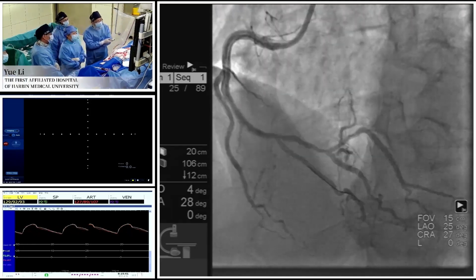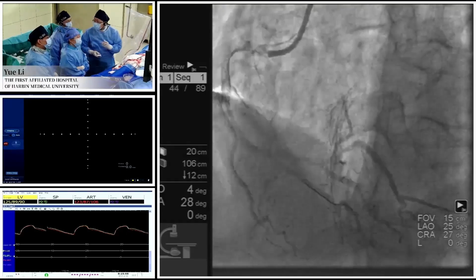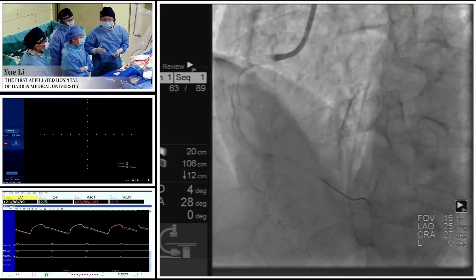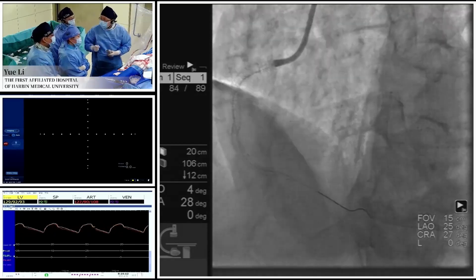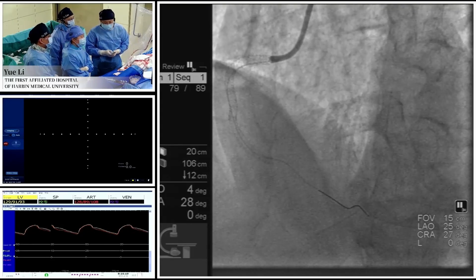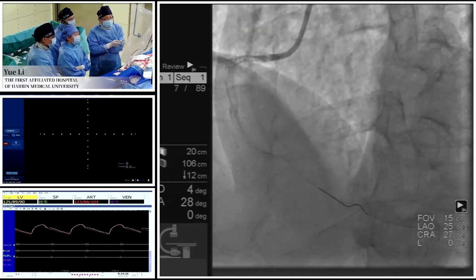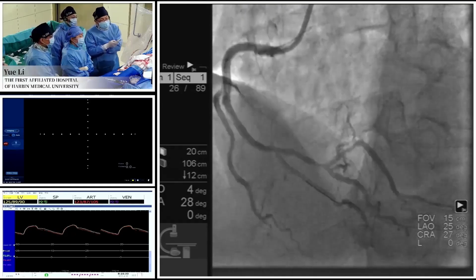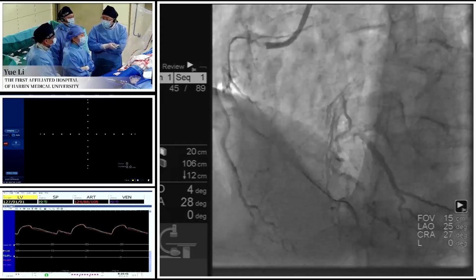Firstly, we do the RCA angiogram and use just a Judkins Left 3.5 guiding. I think this guiding for the transradial approach has stronger backup support than the common Judkins Right guiding. One tip and trick is to straighten the second curve of the guiding a little bit. So this guiding can easily deep seat, and could give relatively enough backup support. And certainly, if the backup support is not enough, we also could use many other techniques like anchor balloon and Godzilla, etc. Another advantage compared with the EBU guiding is that Judkins Left 3.5 guiding is safer.